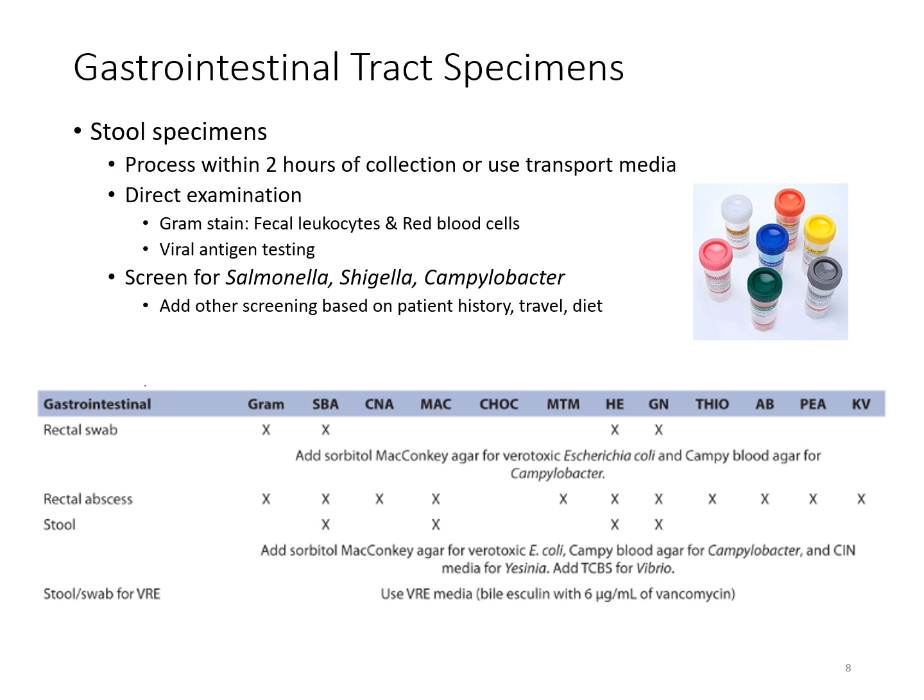Sometimes a stool may be submitted that's not in any sort of preservative, just to look for the hemoglobin, checking for the presence of blood in that specimen, occult blood. And of course, there you could do things like C. diff testing and things like that, looking for those antigens.